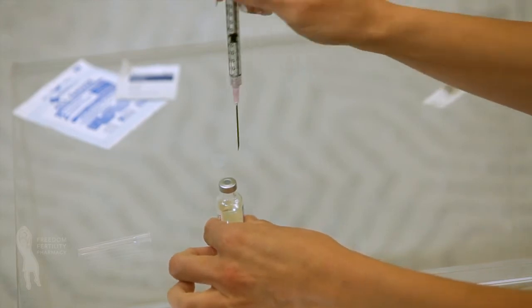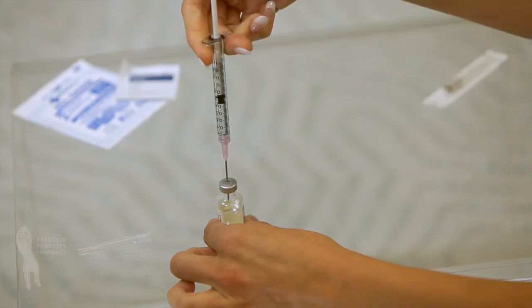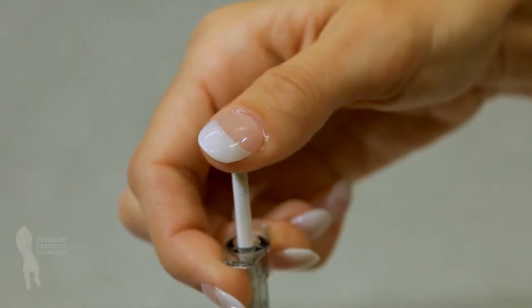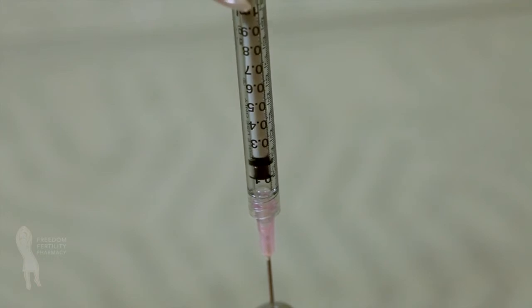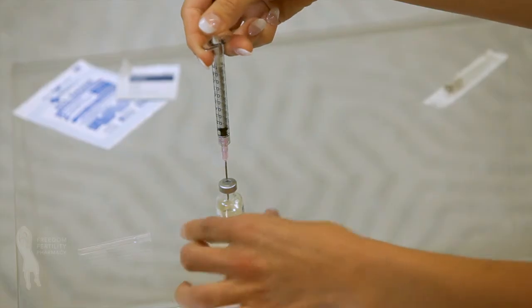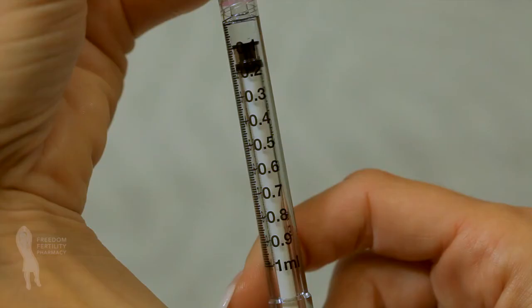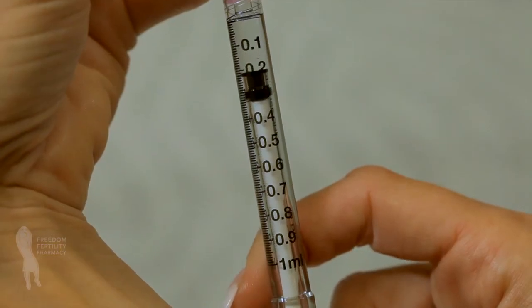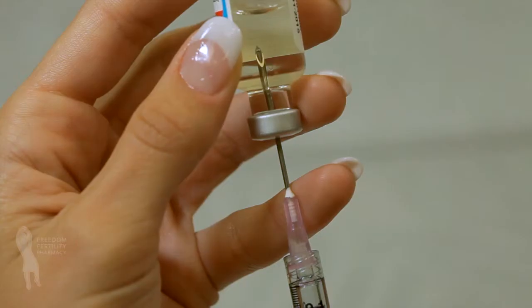Carefully insert the needle through the marked center circle of the rubber stopper into the vial. Gently press on the syringe plunger. This will allow air to enter the vial, which makes withdrawing the solution easier. Without removing the needle, invert the vial and slowly pull back the plunger as far as needed to withdraw the milliliter or cc dose of medication that you have been instructed to take.